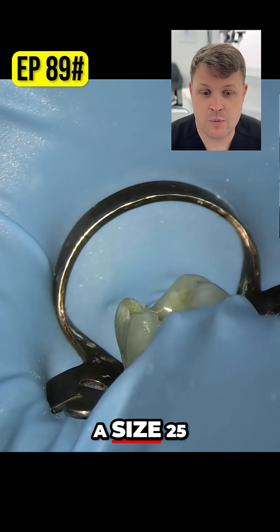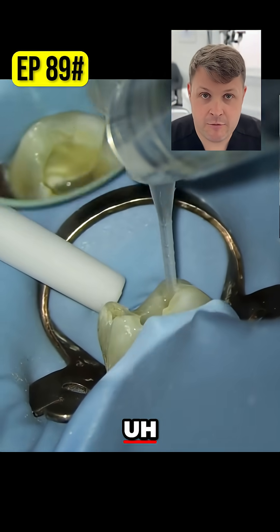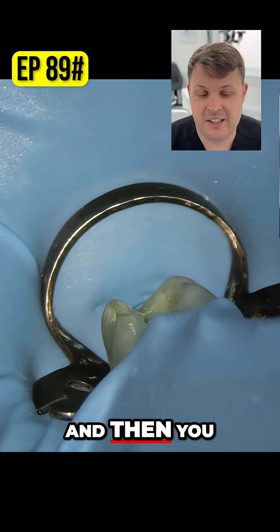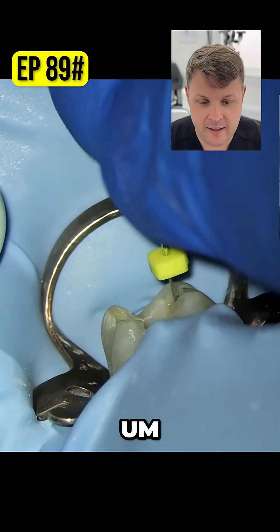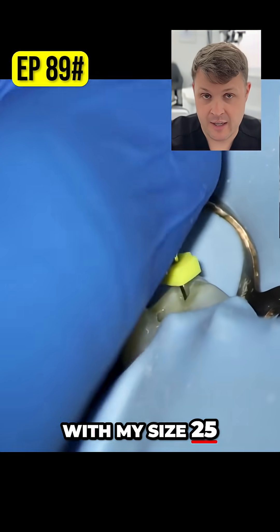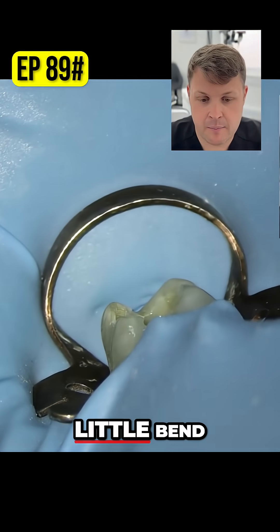So I'm just going to use the same process — make a little bend at the end with the size 25, T-Mode, get it passed, and then you can see here that I've shaped really, really nicely to the working length with my size 25 in the palatal, despite that little bend at the end.